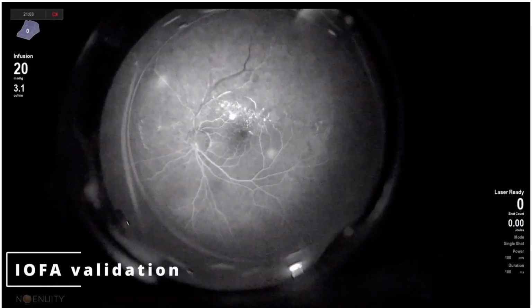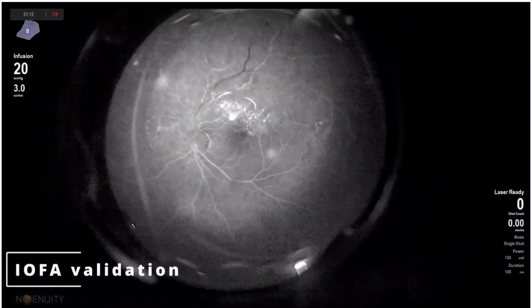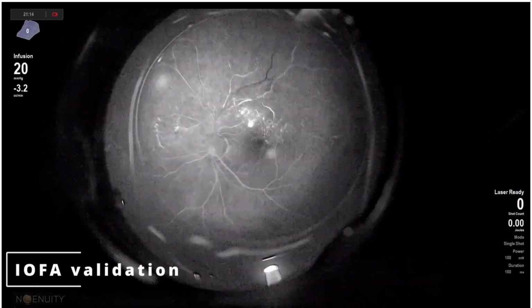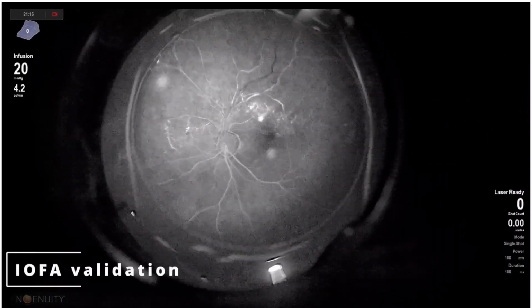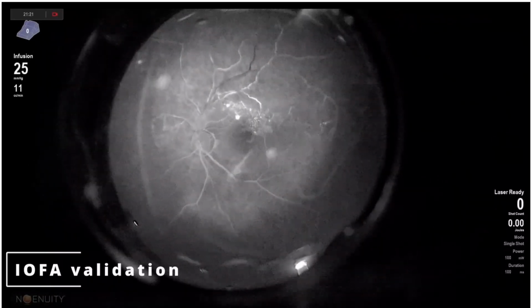So where is the advantage of the blue light reflectance? If we don't want to use fluorescein intravenously, or if the patient is highly allergic, we still might be able to evaluate and treat the areas of non-perfusion.